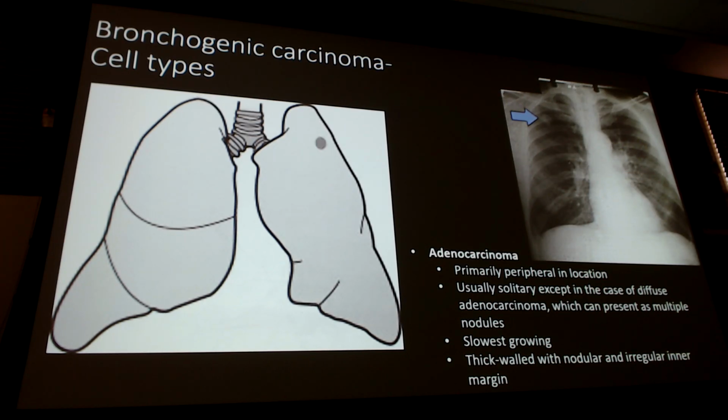But how many radiopaque circular round nodules in the peripheral locations of the lungs have we talked about so far? Like none. Someone say TB. Yeah, so TB, but TB is cavitary, right? A little bit bigger in cavitary, like when we saw that cavitary pneumonia. That's a good point. So TB is a possibility, absolutely is. Not necessarily really cavitary on this guy, a little bit more solid. Maybe you will see a little bit of cavities in there. But what's TB definitely going to come with? TB is going to come with some of those infection type symptoms. This guy, or gal, is a lot of the times probably asymptomatic, especially this early on.